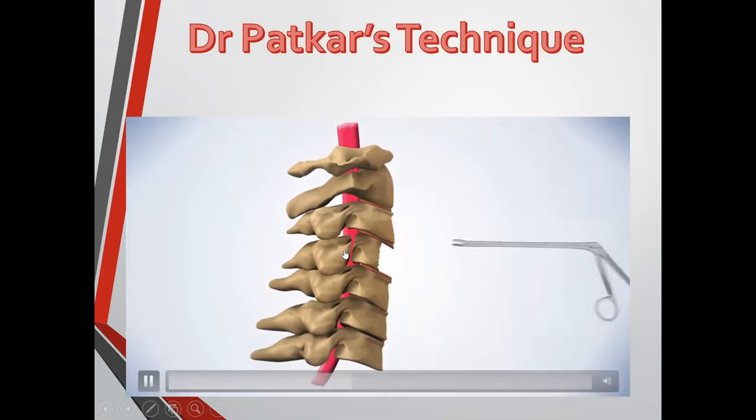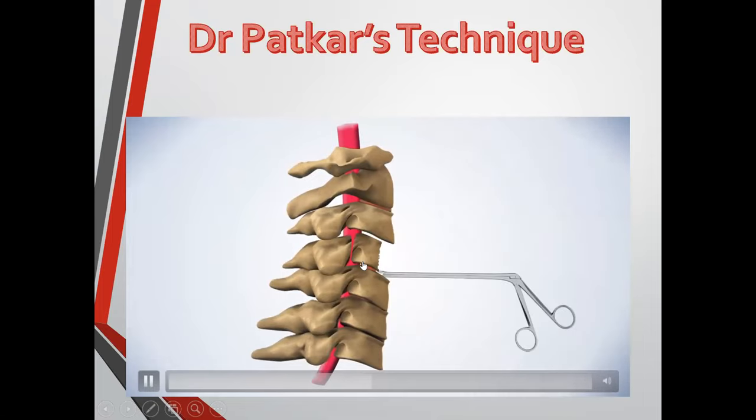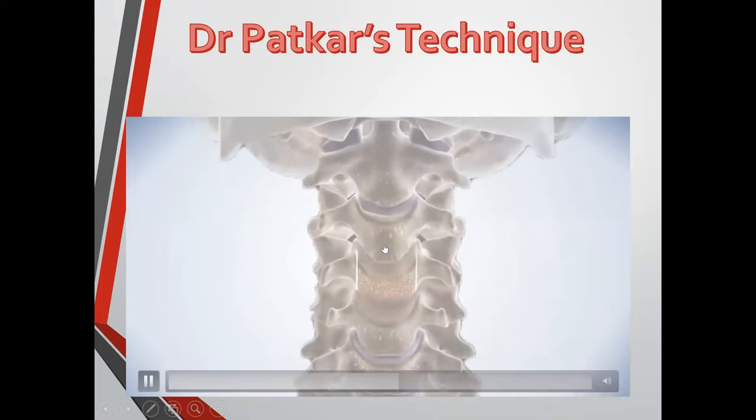The discectomies are done on both sides, of course. You must curette and get bleeding bone from both the end plates before you put bone graft inside. That is the most vital step of anterior surgery, to have bleeding bone from either vertebral edges. Then put a plate.